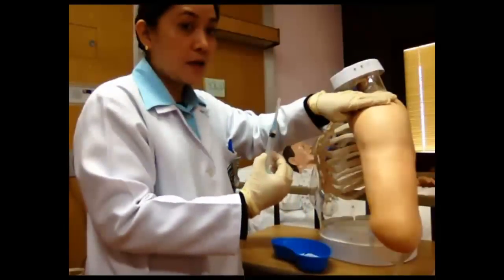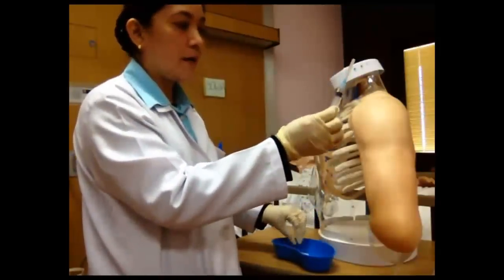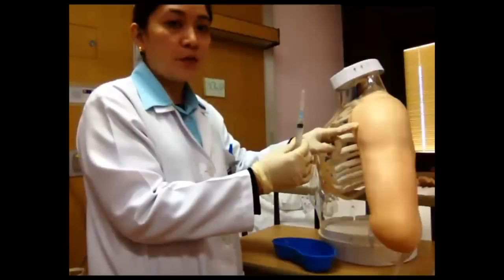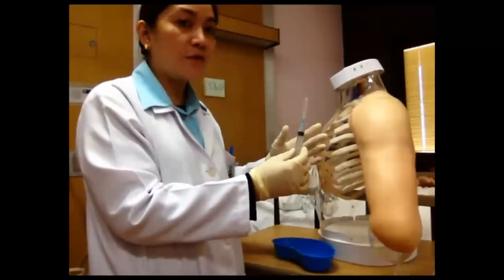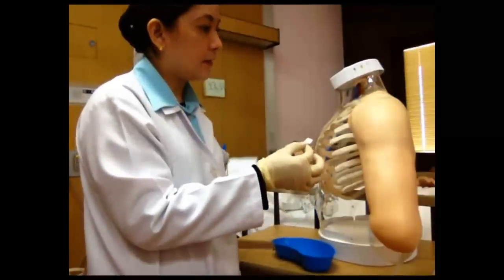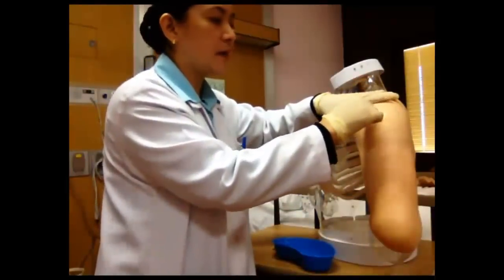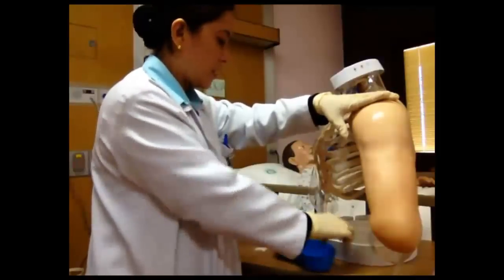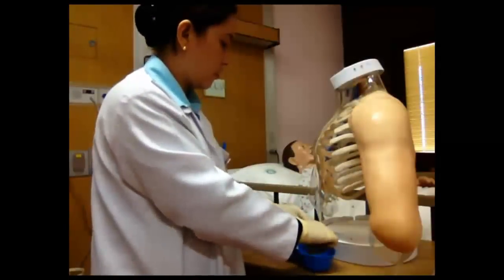With your prepared medication, with your 1 ml medication, remember, the medication given to the deltoid muscle should be 2 ml and below. But if it is more than 2 ml, you have to give it to the gluteal muscle. First, we have to clean the injection site in a rotating motion from inside to outside, about 2 inches in diameter. Make sure that you have your band-aid ready for after the injection, and another alcohol wipe.